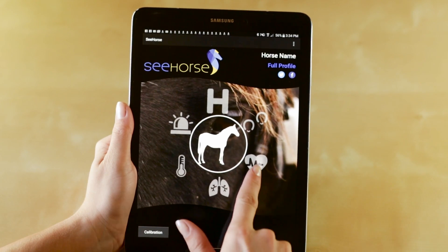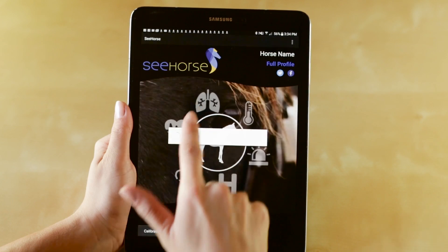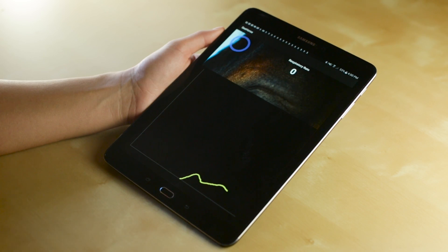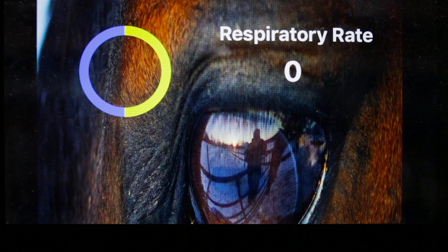If you are logged into the app and connected, simply click on the lung icon to begin monitoring. You'll see a blue circle in the top left-hand corner of the screen. Once this circle begins loading with yellow, it represents each breath that your horse is taking.